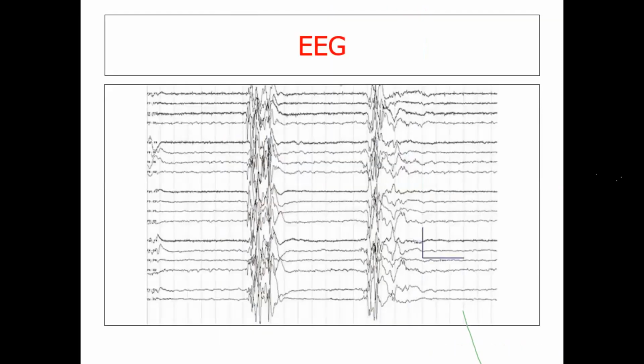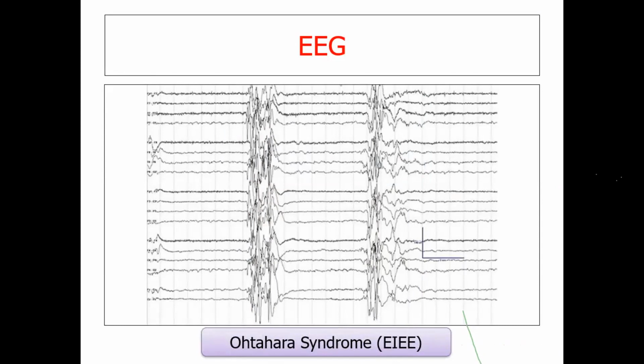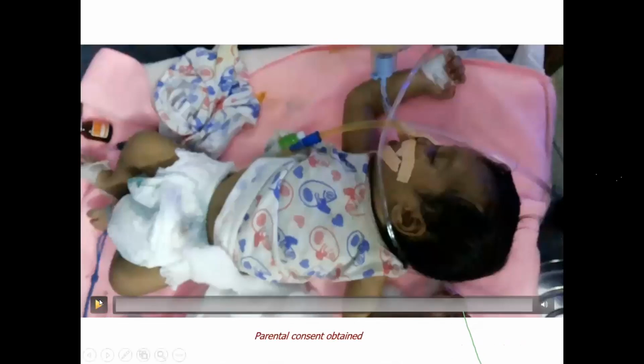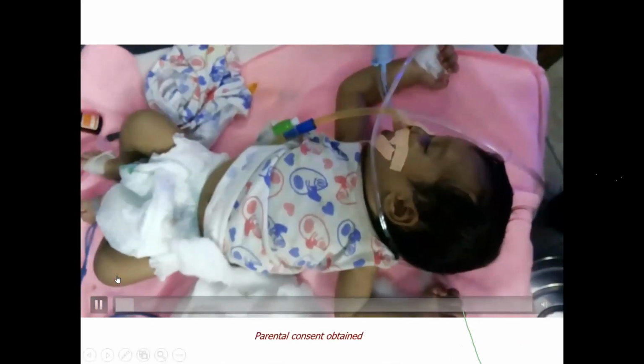The EEG is not of this baby, but we have taken a representative EEG which was similar. It was a classical burst suppression pattern. After detailed workup, the baby turned out to be a case of Ohtahara syndrome with some structural abnormality in the brain. I'll talk about that. But before that, let's see another video.